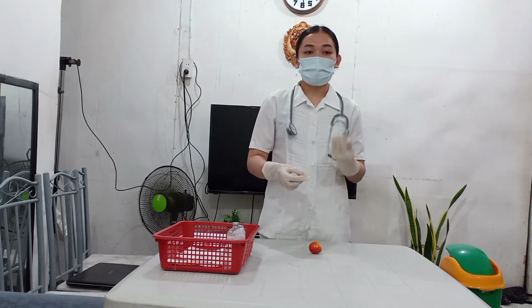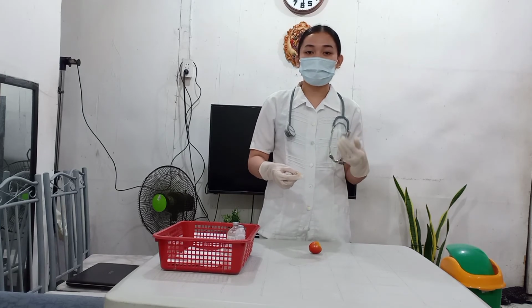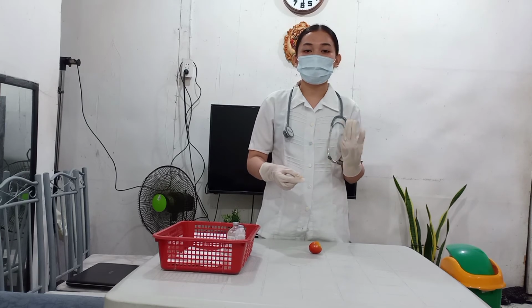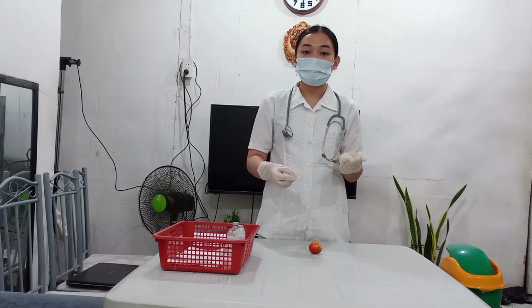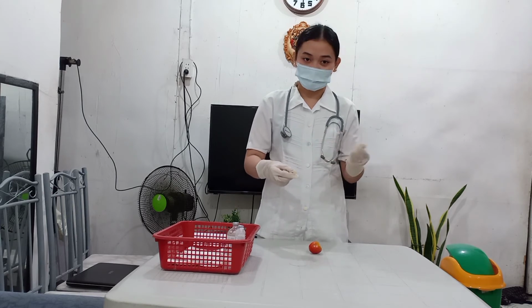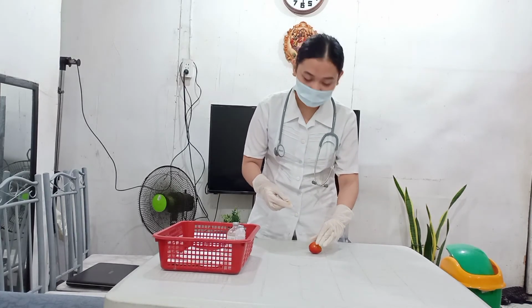Next, we pinch the skin with the non-dominant hand. Pinching is advised for thinner patients in order to lift the adipose tissue up and away from the underlying muscle and tissue. So, we're going to pinch this.